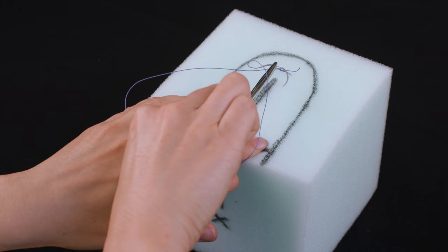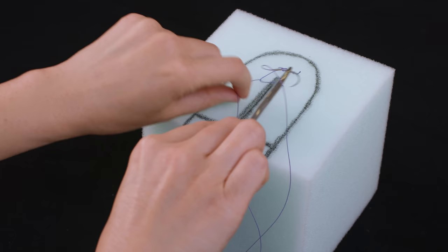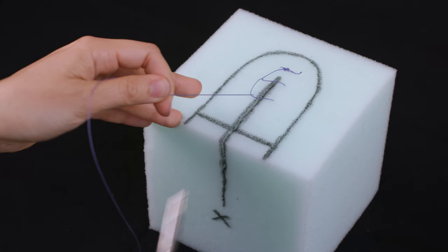Re-approximate the vaginal mucosa and underlying tissue by running the suture towards the exterior in a continuous fashion to the level of the hymen. I will do my running suture in a locking fashion, which helps prevent shortening of the vagina. Suture bites should be placed around one centimeter apart and half to one centimeter away from the edge of the tear.